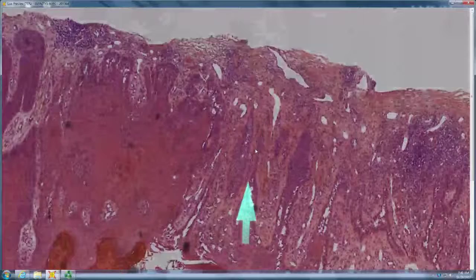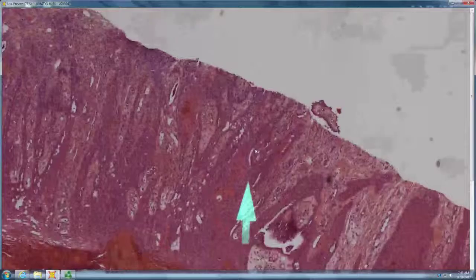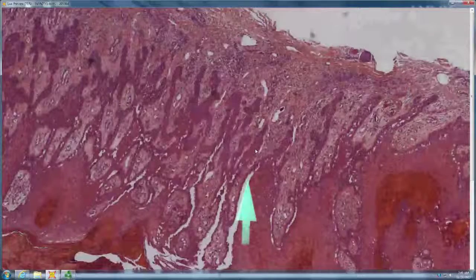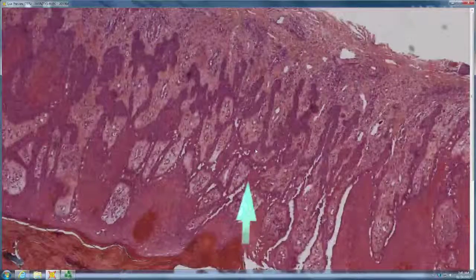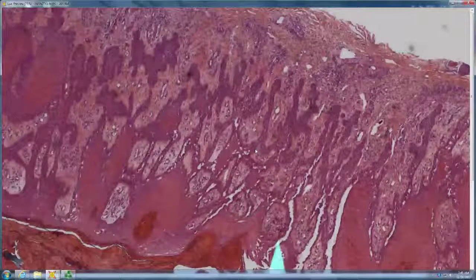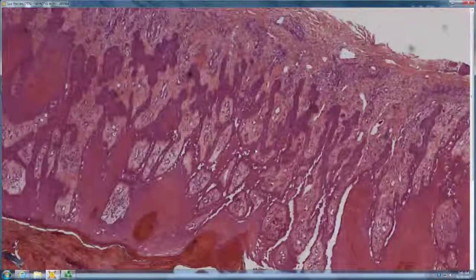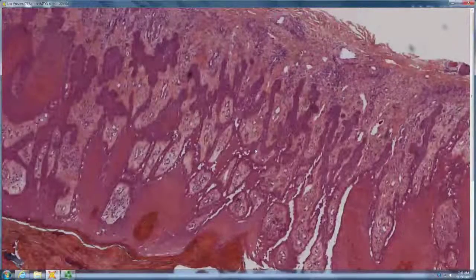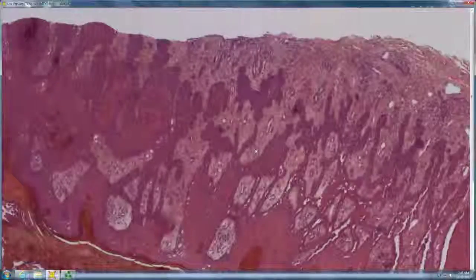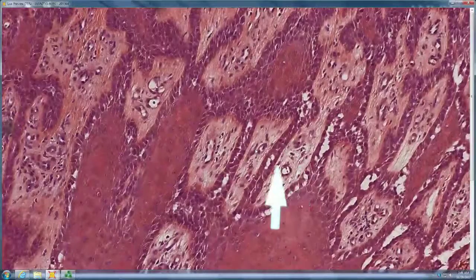So what do you see? So it appears to be some prominent acanthosis with very long, stringy, reedy rete. Makes me think of lipoid proteinosis with the hyperkeratosis as well. With lipoid proteinosis, the key would be the pink hyaline rings in the papillary dermis and around adnexal structures and blood vessels. Don't really see any hyaline rings here.